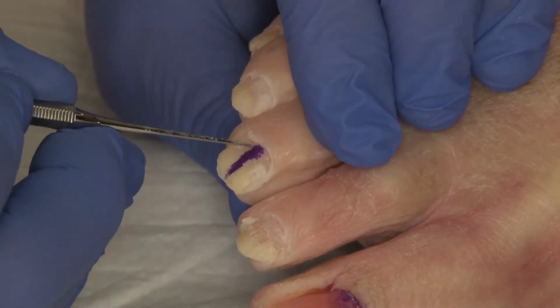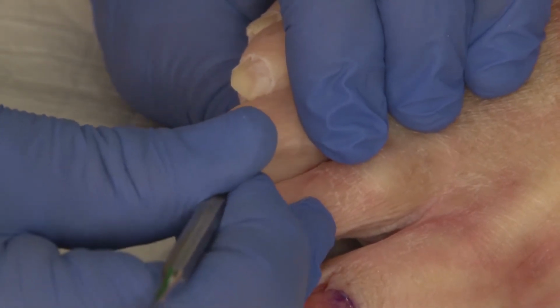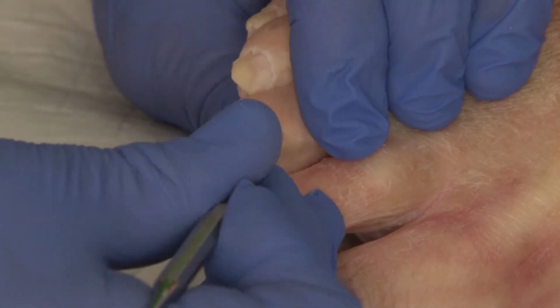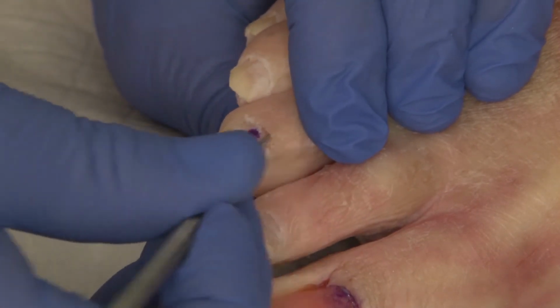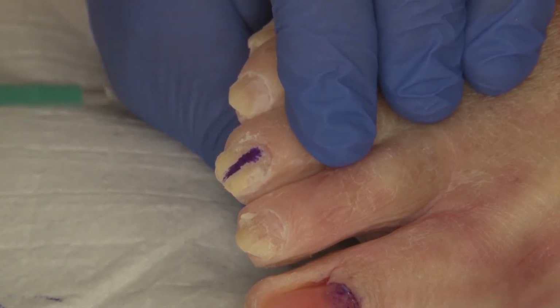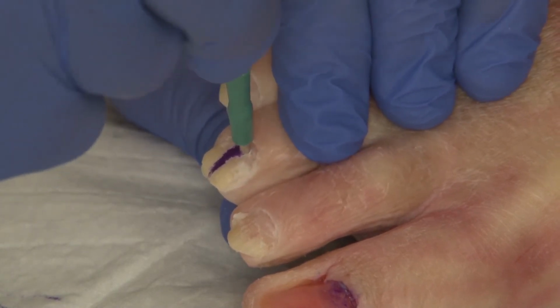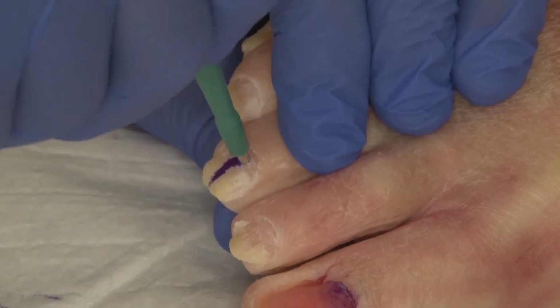Using a packer, we're going to reflect the nail fold to identify the most proximal portion of the streak. And as we could see in this demonstration, we do not have the need to reflect the fold. Now we're going to take our 3 millimeter punch and orient it 90 degrees to the proximal aspect of the streak, and we're going to insert and do the punch right to the periosteum of the phalanx.